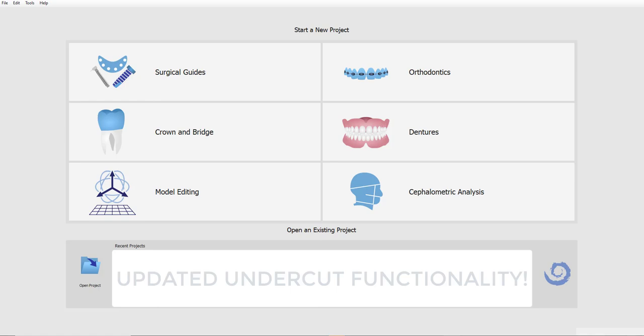Hello, everybody. This is Michael from BlueSkyBio. In our previous software release, we made some changes to the path of insertion and generation of undercut models, which caused some confusion for some of our users.